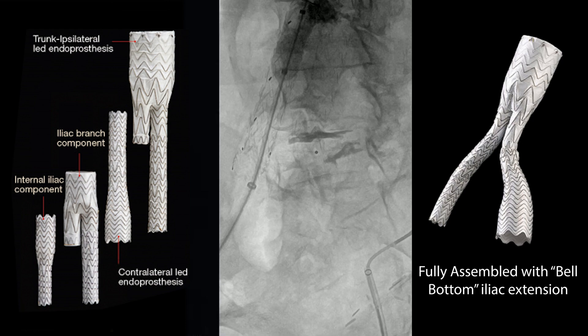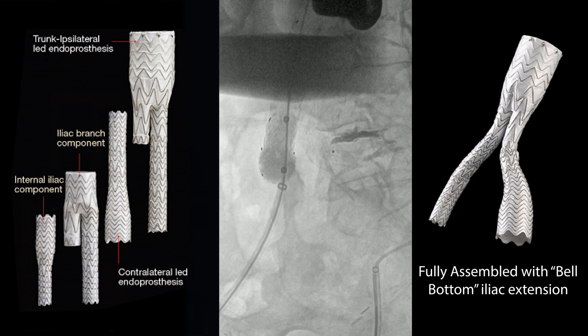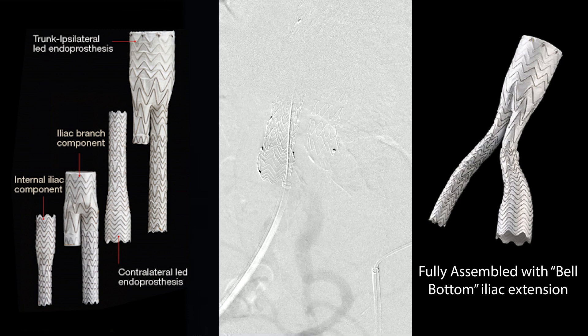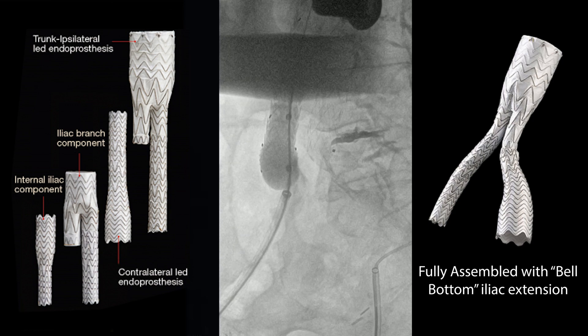Here we're doing the overlap zone, sequentially moving this on down, and you can see how it flares out, accommodating the distal end of the bell-bottom. Here it looks like there may still be a little bit of an endoleak, so we're going to come back in with a bigger balloon and hit it a little bit harder.